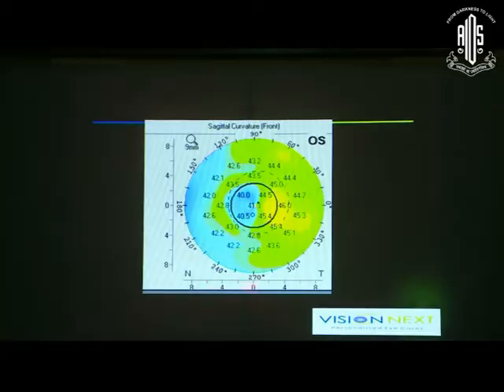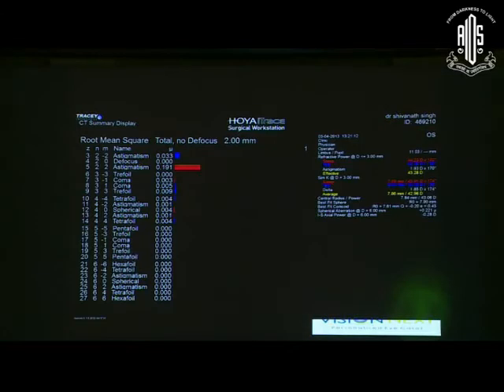If we look at just around a 4 millimeter diameter, the astigmatism is 3.2, as compared to what the LenStar was showing as 1.4. The point to make here is that the LenStar calculates the keratometry value based on 32 light points that it has. It also has a connector available as an additional for topography, but what we had was the 32 point marker, which takes the keratometry accordingly.